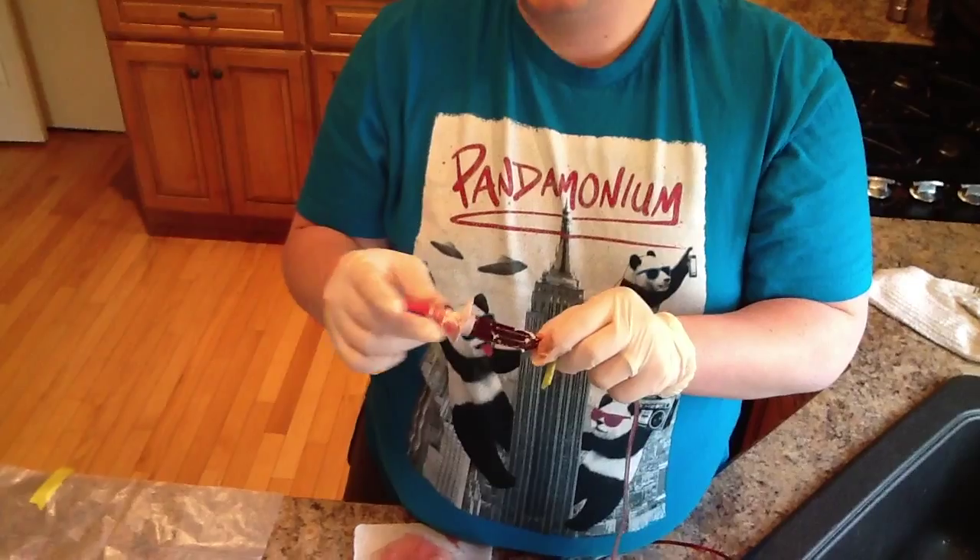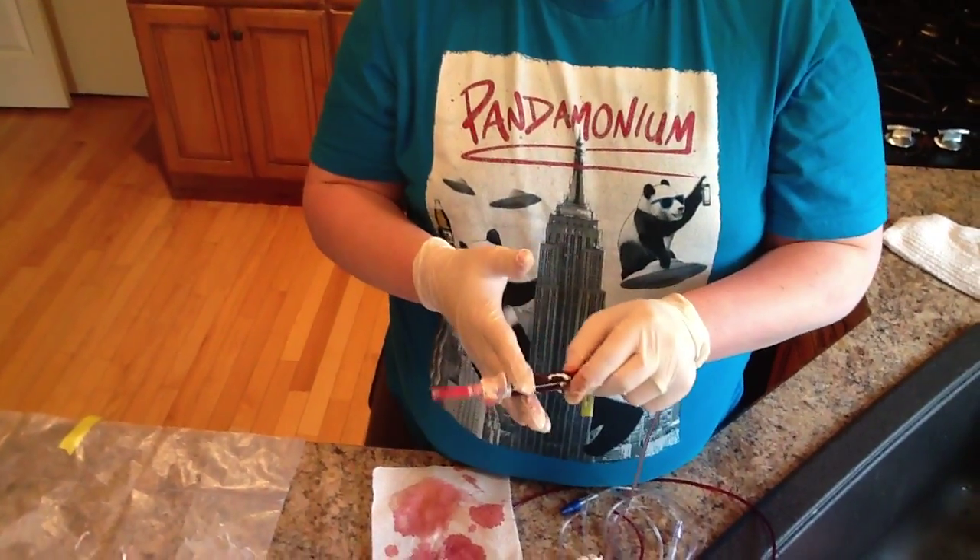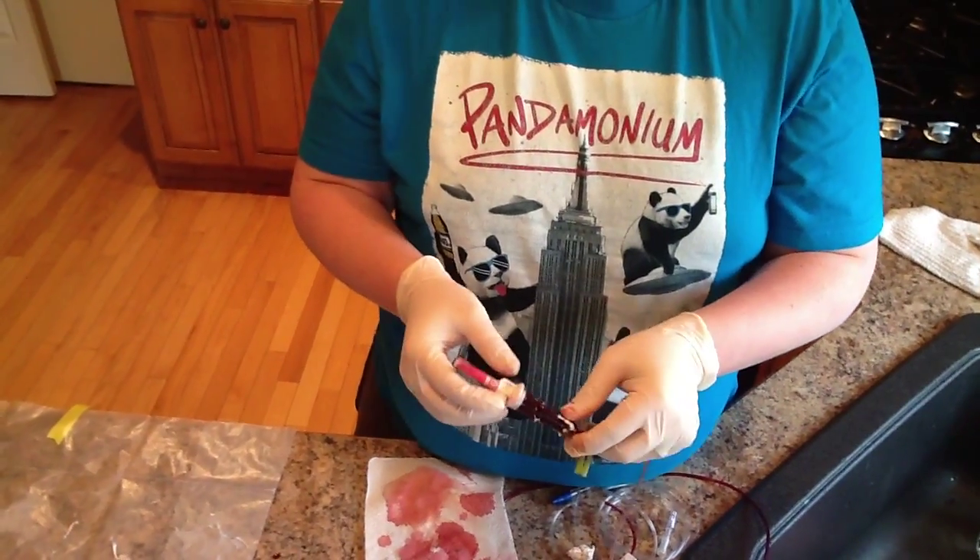What we're going to do after this is we're going to actually drain these of the blood, cut a little cross-section of the plastic, so we can more closely examine the clot that formed.